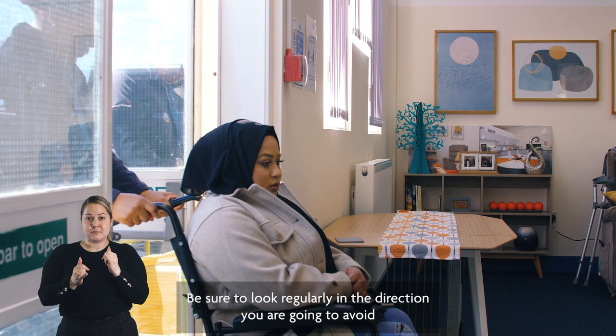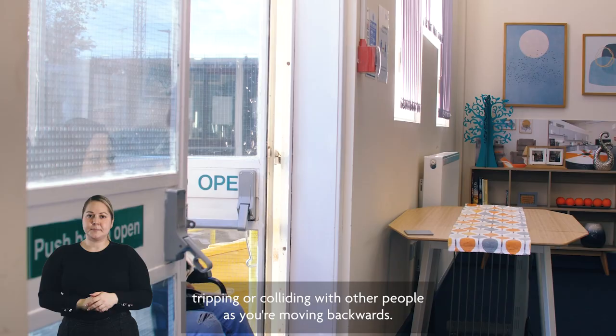Alternatively, for doorways that push open, brace the door with the back of your body before carefully reversing the wheelchair through. Be sure to look regularly in the direction you are going to avoid tripping or colliding with other people as you're moving backwards.